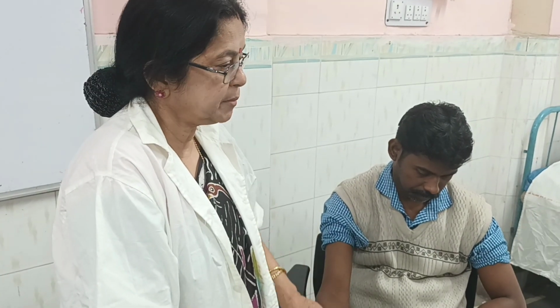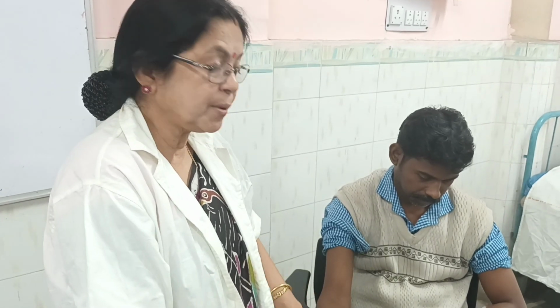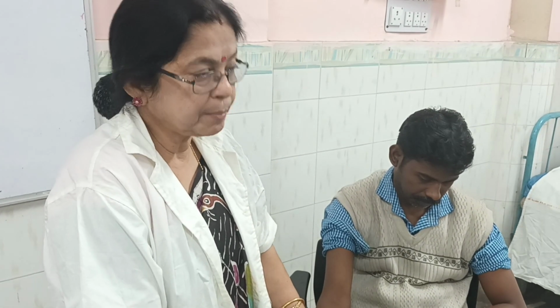In all the hospitals, with the sisters and everybody, I don't blame anybody, but most of the doctors or many good people do not do the palpatory method. But the palpatory method is safer for the doctor or paramedical staff or nursing staff, because it helps us to avoid the auscultatory gap and gives us a rough idea of the systolic blood pressure. And the systolic blood pressure, if we auscultate over here, will be 4 to 6 millimeter of mercury more than the palpatory method I have mentioned. Sufficient blood has to come over here, then we get the SBP in the palpatory method.